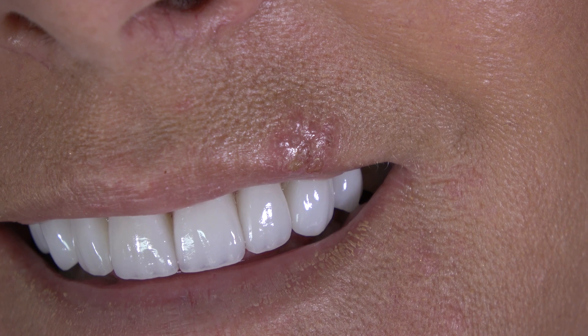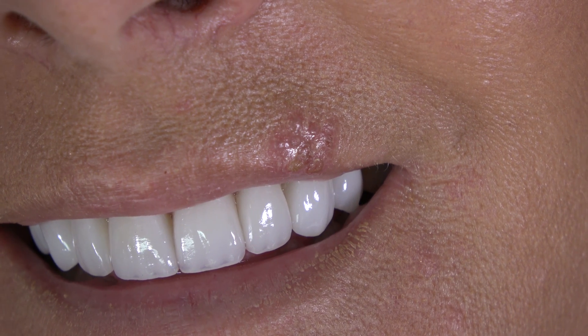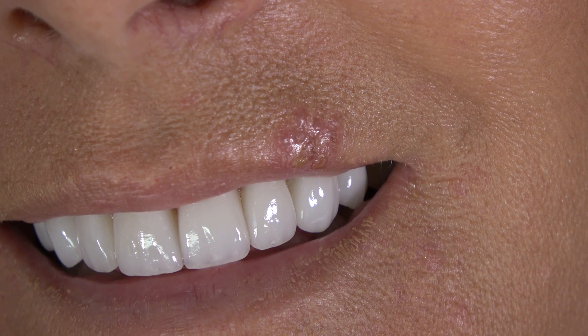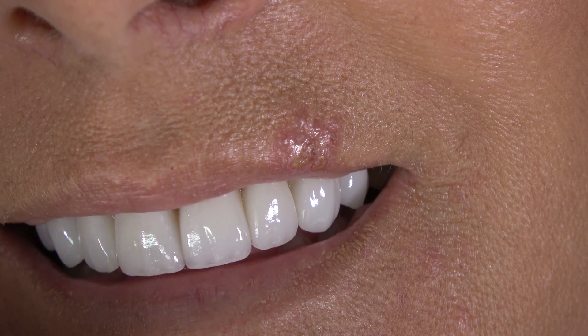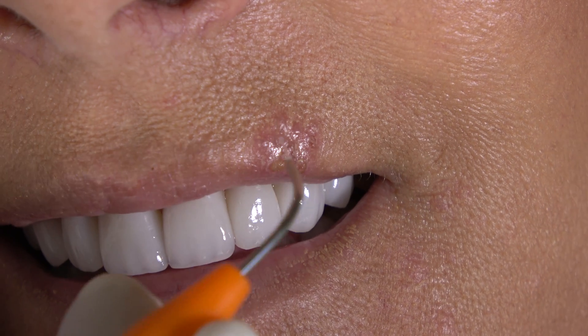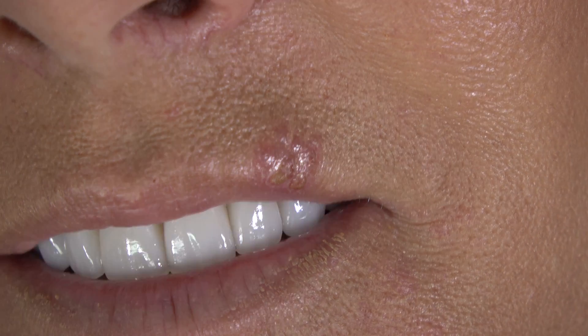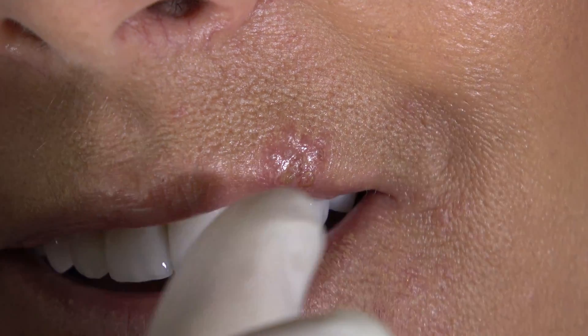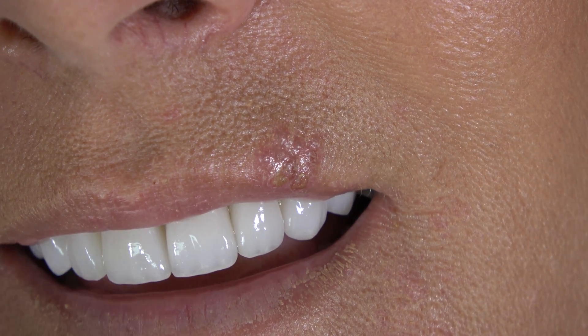We're going to use the AMD Lasers Picasso Lite, which is a diode laser. Again, an uninitiated tip, I have it set for 0.5 watts continuous wave. Now Erica, you're going to feel this a little bit. As you feel it or it gets too uncomfortable, just raise your hand and I'll catch it at the periphery of my eye, and then I'll pull back.